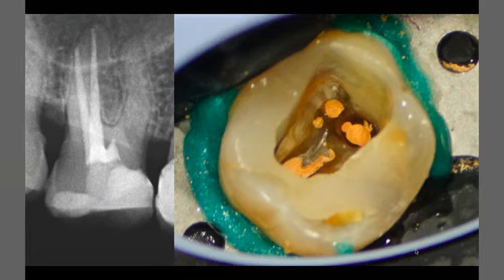He drilled in another pathway, so he stopped. And this is a very good thing: to stop when you couldn't find the root canal. Don't drill more, otherwise you will perforate the tooth. So he stopped, and then he did the final restoration. And he told the patient, we will reassess the tooth after maybe 6 months.